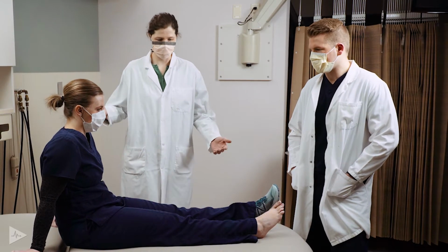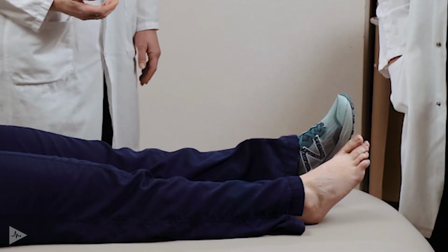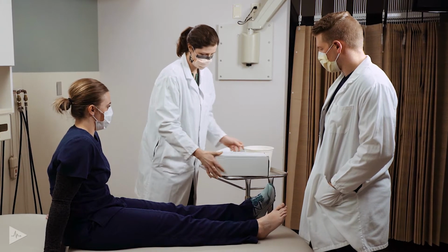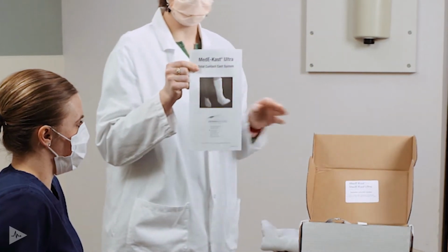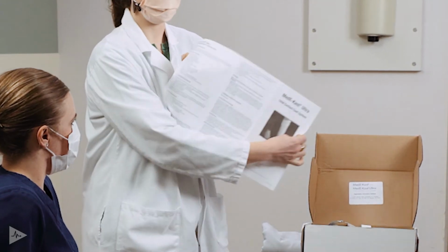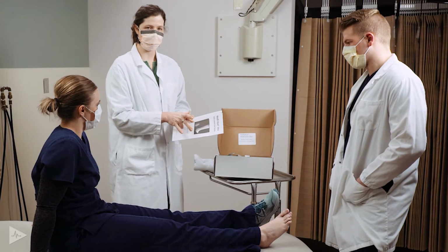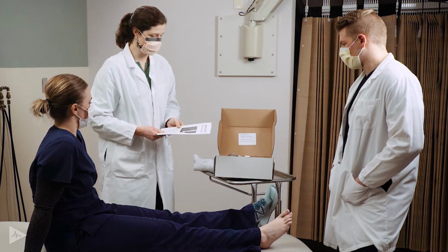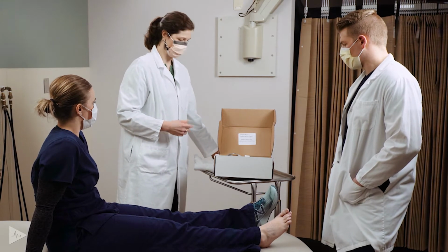I generally will have the patient start in a seated position. For this demonstration, we will have an ulcer on the bottom of the right foot. We have our total contact cast kit, and we'll have all the components available. So in every kit, you will have the instructions available step by step. So for your first few kits, that can be followed. And we'll also have the review of the indications and contraindications. You will also have a small piece of paper for specific removal instructions. And be sure to give this to your patient, as a total contact cast is not removed the same as a cast used for a broken bone.